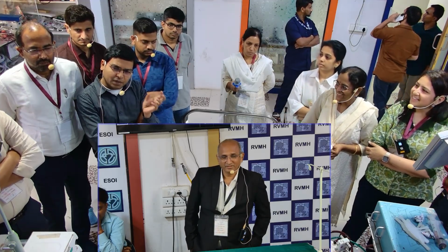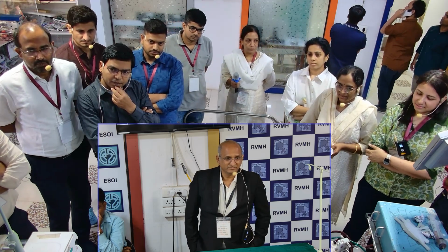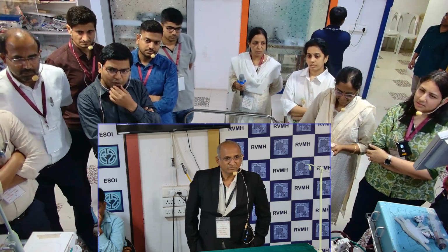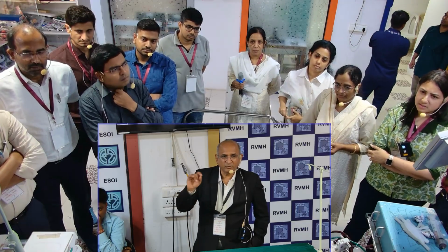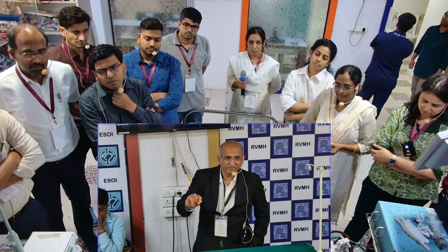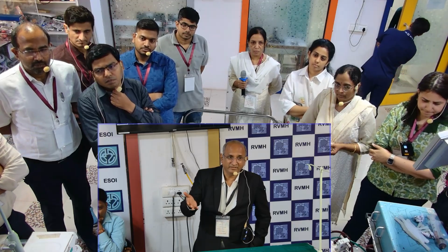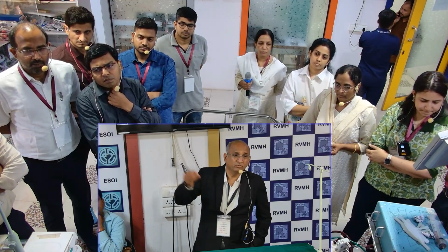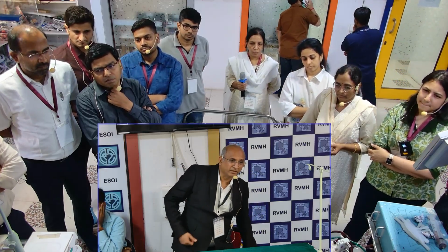But will an HME filter problem present as a sudden change, sir? Yes, it will. No, see, what happens is condensation occurs in the HME filter and it gets clogged. Even if the flow comes down suddenly, you will not realize it. It's not going to take days; it may be a few minutes and it gets stopped completely.